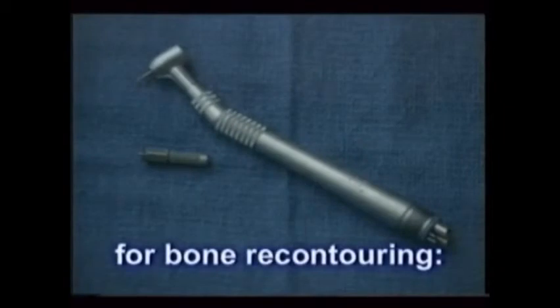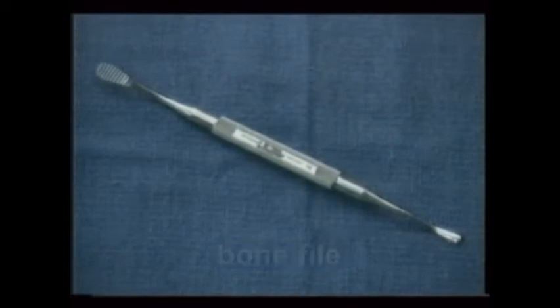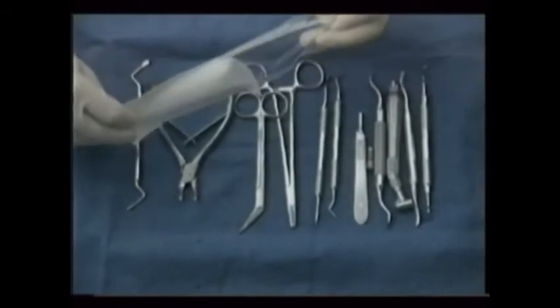If bone recontouring is required, hand instruments, the air-driven handpiece, or both may be used. Hand instruments typically include plier-like rongeurs whose sharp beaks snip shards of bone away, and small bone files, which, when used in a push-pull fashion, eventually further smooth and plane the bone back to its normal shape. Finally, the suture materials are added to the setup.